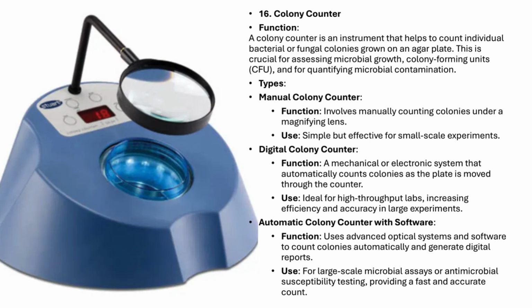Automatic colony counter with software. For even more advanced counting, the automatic colony counter with software uses optical systems and specialized software to count colonies with high precision. It generates digital reports and is perfect for large-scale microbial assays or antimicrobial susceptibility testing.